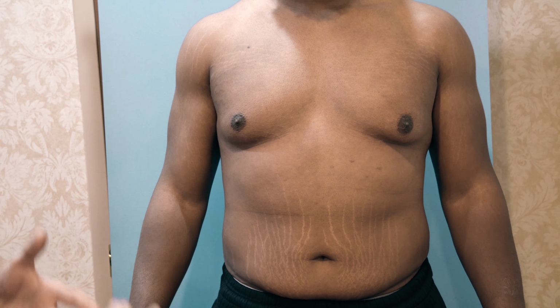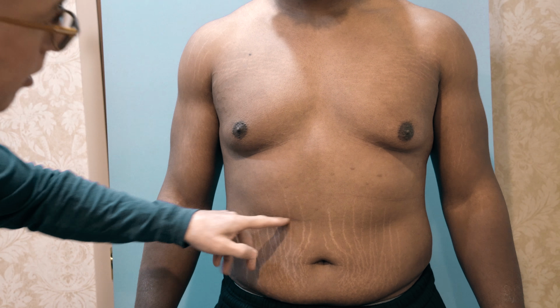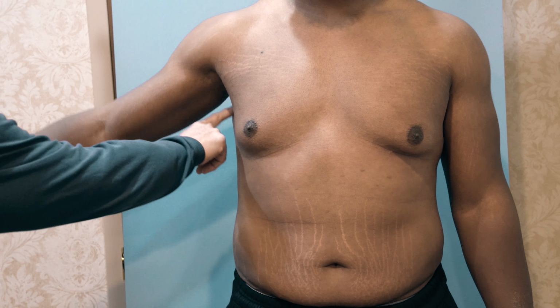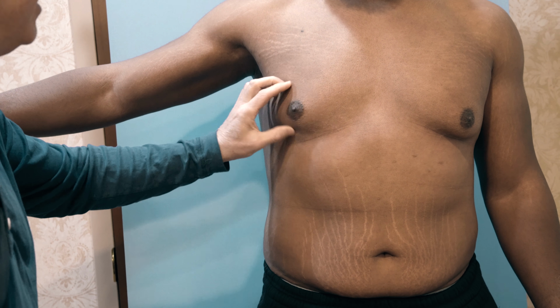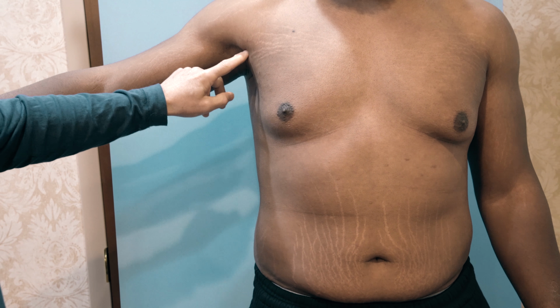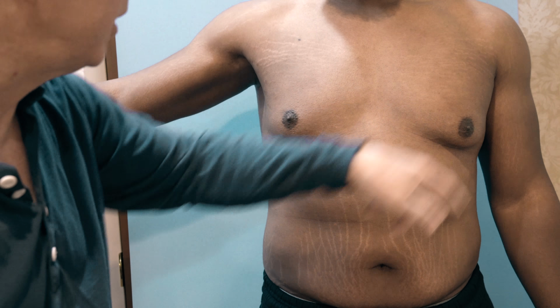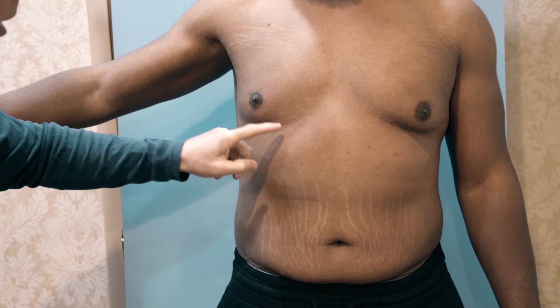And again, when I do an extended gynecomastia, I want to go down to this line here. Sorry, my hands may be cold. All the way over here. Get this gland out, melt it. He's got some gland here, but we'll see how big it is once I make the cut. Stealth incisions, armpit, by the nipples, obviously on both sides, and one right there to etch the midline here and to get the upper six-pack.